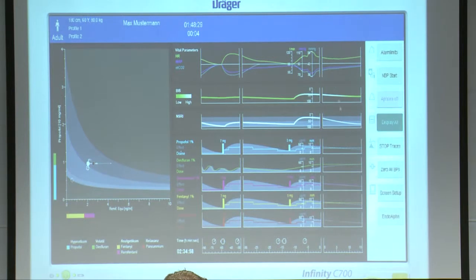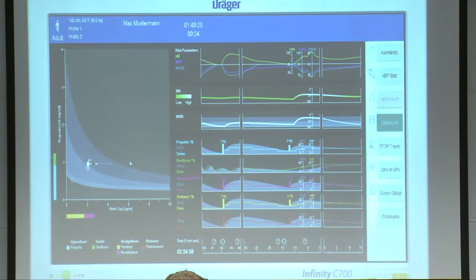And it's nice to have the hemodynamics, should there be a response there from inadequate analgesia. It's nice to see the processed EEG, the BIS, as a measure of consciousness, and then a measure of nociception plotted all together. Very nice, elegant display on the same time axis for managing these drugs. And then on the left, of course, we have the more simplified display of a surface with adequate and light anesthesia and a projection of where the patient's going there.